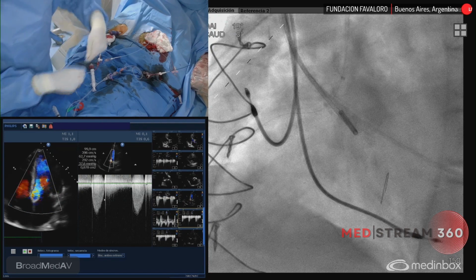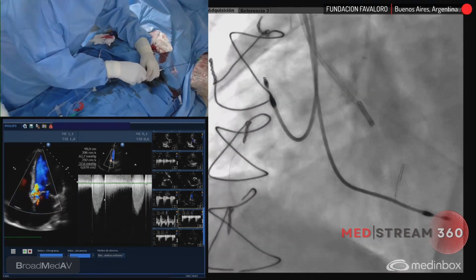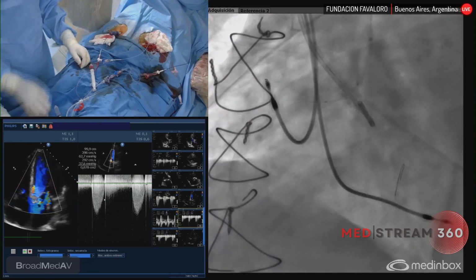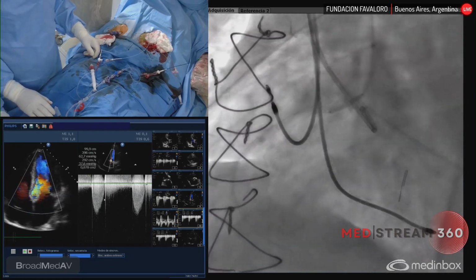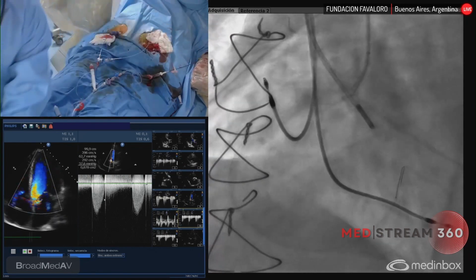If we have a good dilatation, it's going to be okay. I will try to post-dilate as much as I can. This is an obese patient. Here we are, in the middle of the balloon, inflate. 1, 2, 3, 4, 5, 6, 7, 8, 10. So it looks too small, deflate. Let me check. Okay, everything is okay.